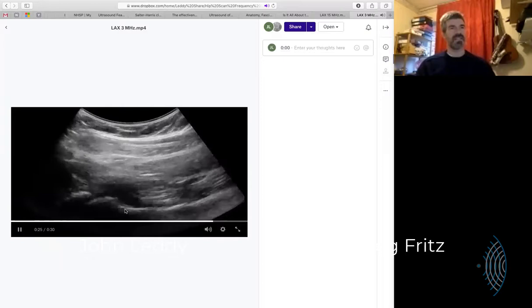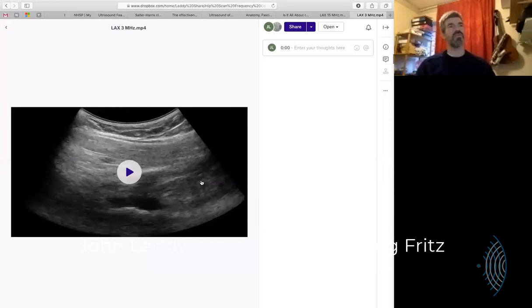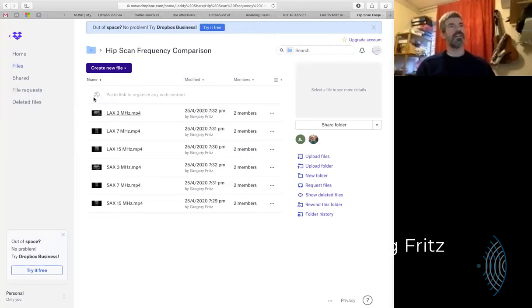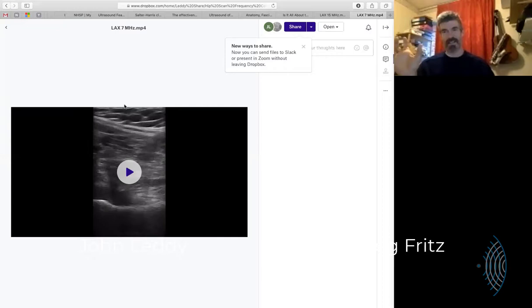It looks like six centimeters, but I'm not sure. Only because — what's the width of your probe? One of the things I always do is I always know how wide my probe is, so that gives me an immediate reference. Normally they're about four centimeters across. So that's four centimeters there, which makes that around about six. It's always nice to have a frame — that distance across is always good to have in your head. Because as you scale up and scale down, it's easy.